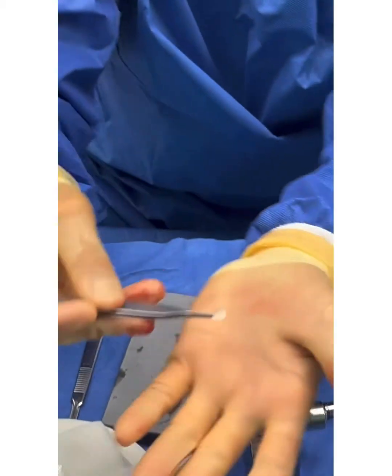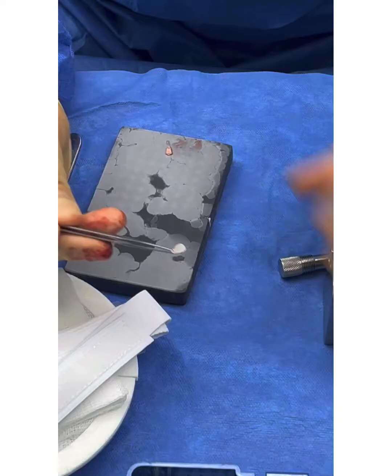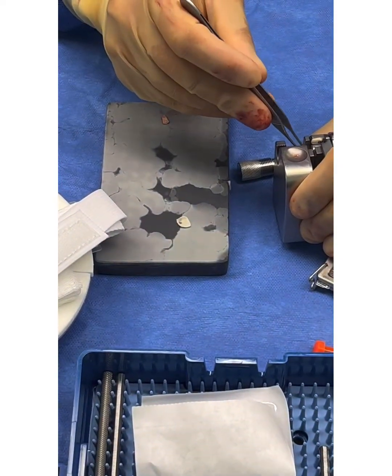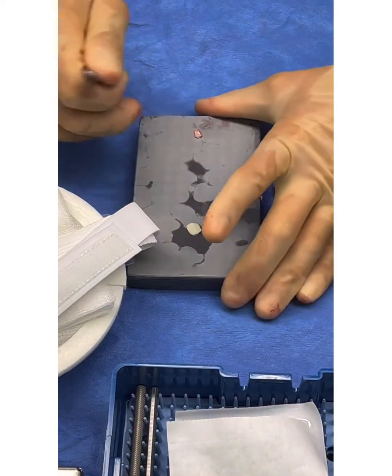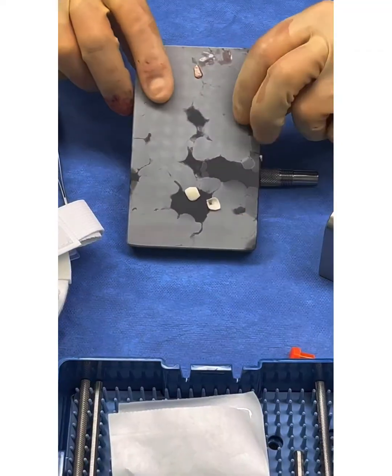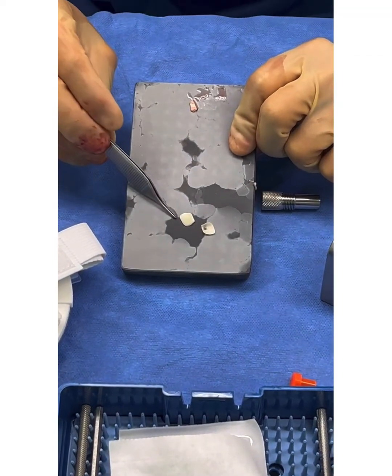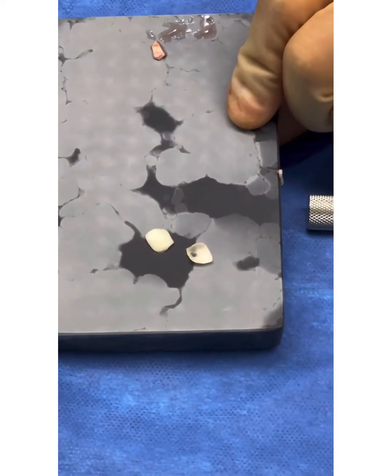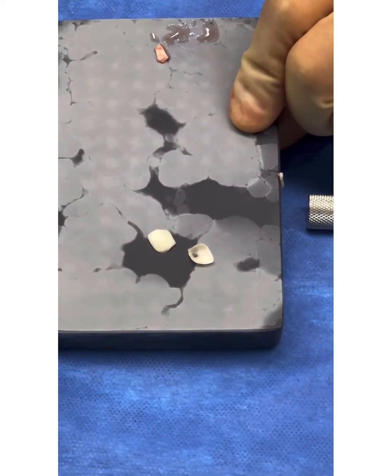Now we open that up and we've got really thinly sliced cartilage that's really nice for making an eardrum. This piece of cartilage is very, very thin — we've got one there and another one here. It allows us to create an eardrum that's strong but not too stiff. These are the thinly cut pieces of cartilage and we're going to shape them to size, then I'll show you how we put them in to recreate the eardrum.